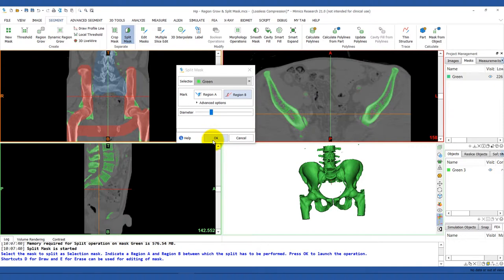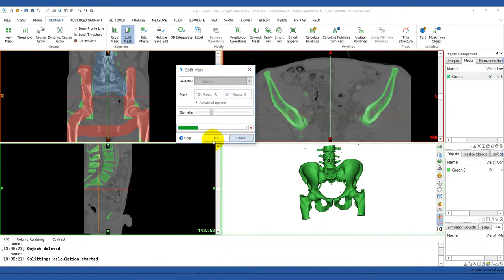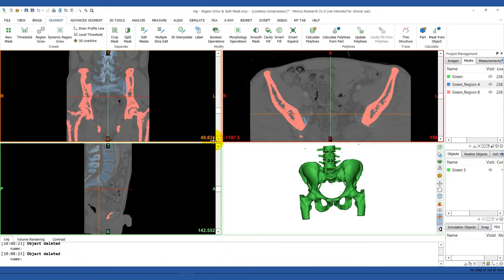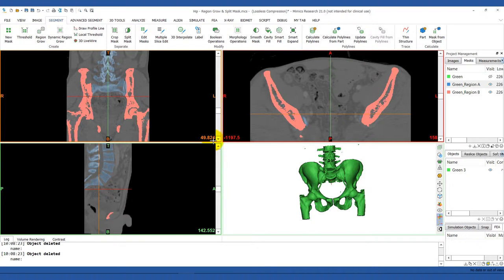Once you've marked your regions, the split mask tool will separate them based on your markings and the image intensity gradients.